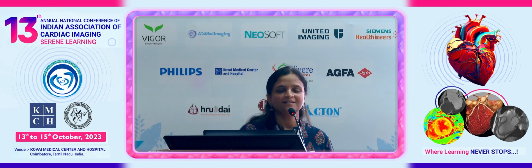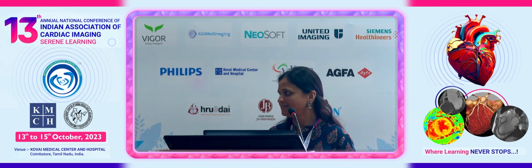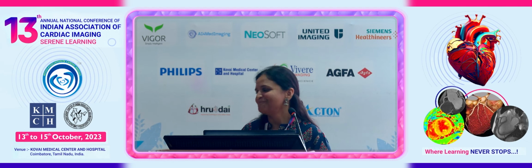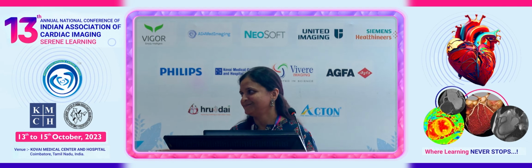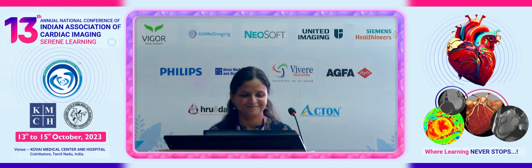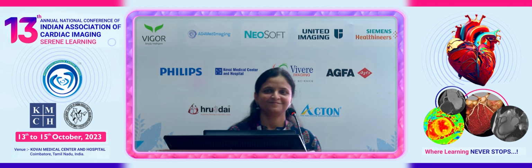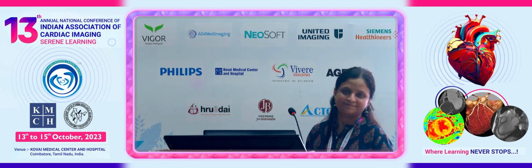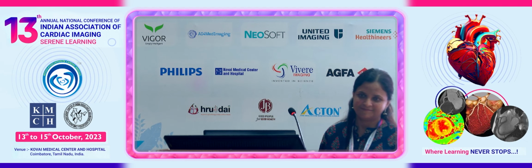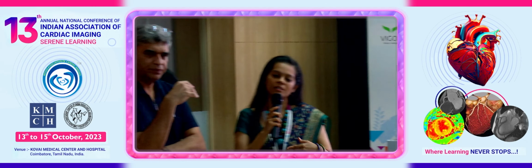I would like to share one thing here, because sir spoke about sedation. In the last 1.5 years, we've not been sedating babies at all. We just wrap them, and we've been able to get beautiful images. What scanner are you using? 256. So it's important to know what scanner you're using. One gated, one non-gated.